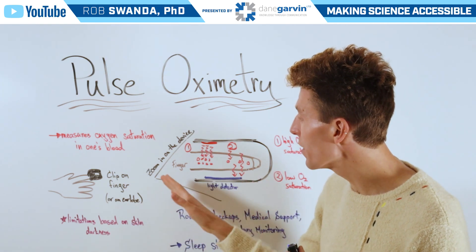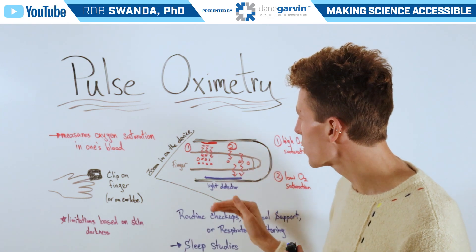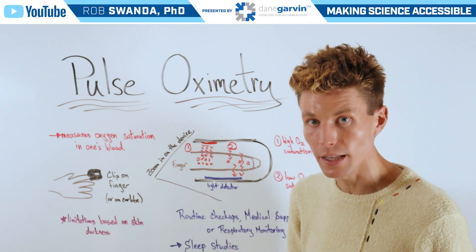If we zoom in on the device itself, it's composed of a light emitter emitting infrared light, as well as a light detector.